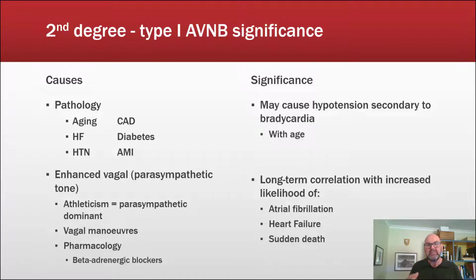Well, in symptomatic patients, the presence of a type 1 second-degree block should always be considered a worrying sign. It may point to the presence of an inferior or posterior AMI if the right coronary artery is involved. And while the incidence of this is rare, it's always a good thing to go back and double check your ECG to make sure that this is absent.